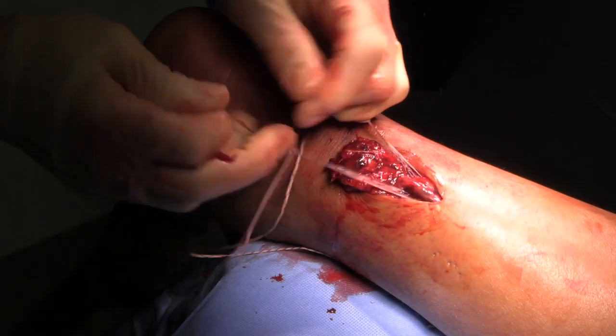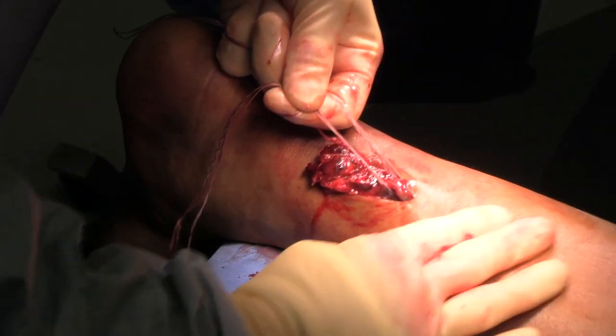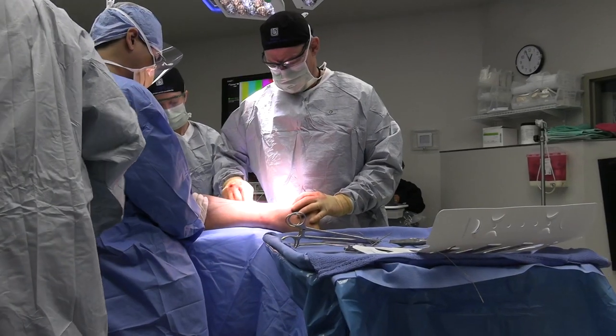I'm inside the tendon sheath and I've got really strong control of the Achilles tendon up here on the inside of the tendon sheath.